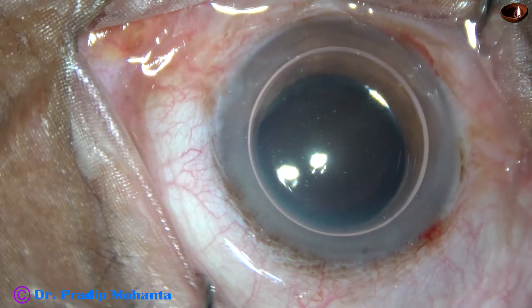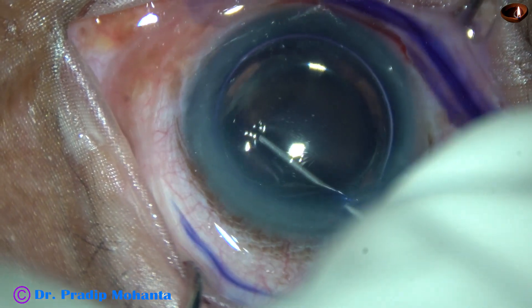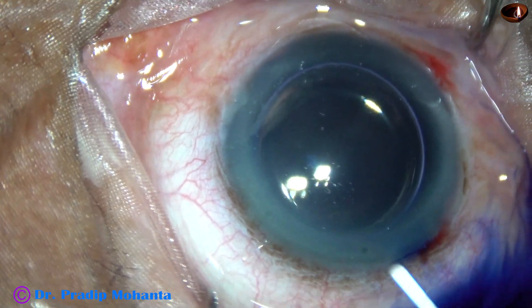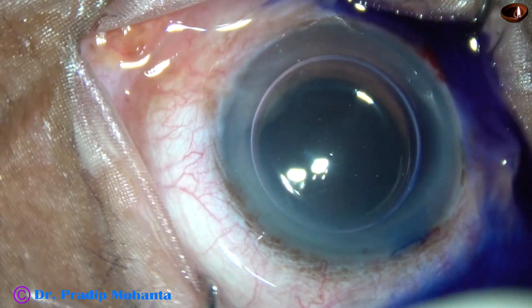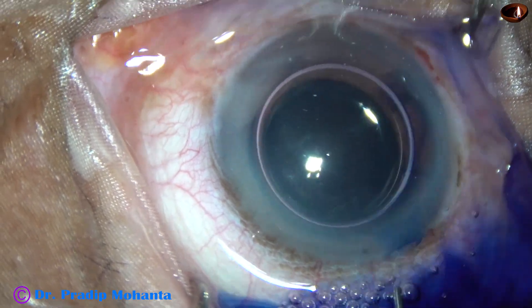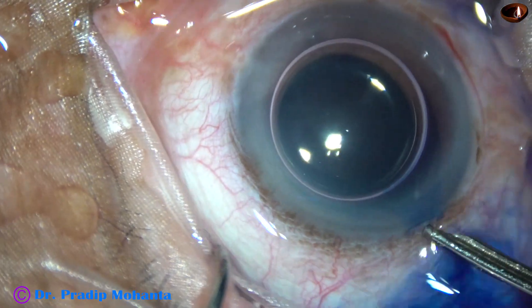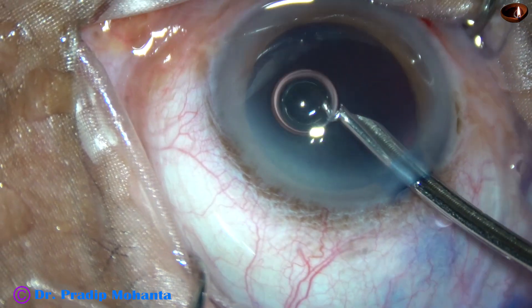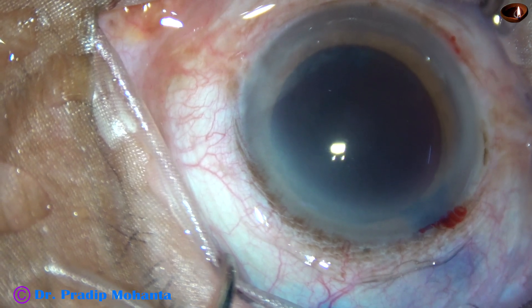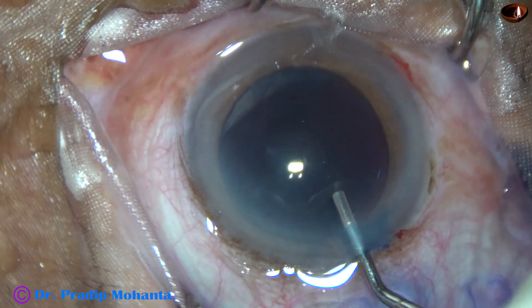After the initial steps, the anterior capsule is being stained with trypan blue dye. And now I am going to use adrenalin as well as phenocaine. Phenocaine contains lignocaine, tropicamide, and phenylephrine. Now the dye is washed out and the anterior chamber is filled up with 2% hydroxypropylmethylcellulose.